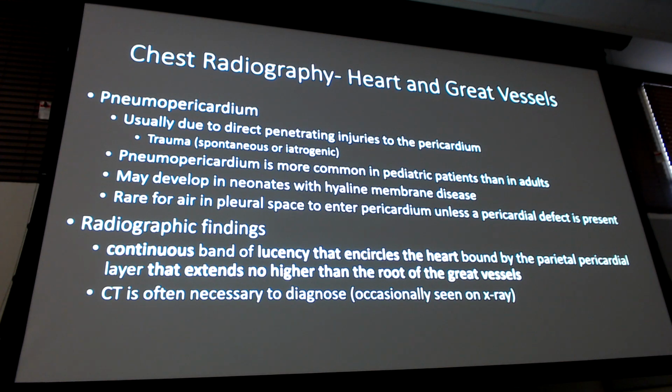Why? Because in order to have a pneumopericardium, there has to be some kind of damage to the pericardium. So we already have that entryway and exit way on the X-ray. So what I'm saying is if you see both, it wasn't pneumothorax leading to pneumopericardium. It was the other way around. The pneumothorax is a sequela of your pneumopericardium or pneumomediastinum. Okay?